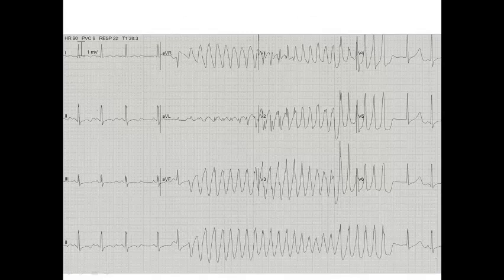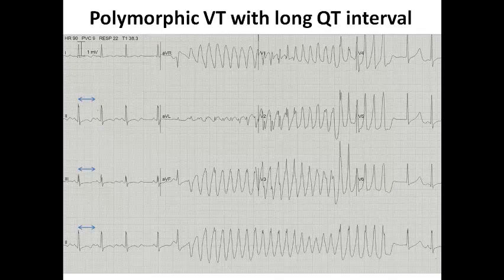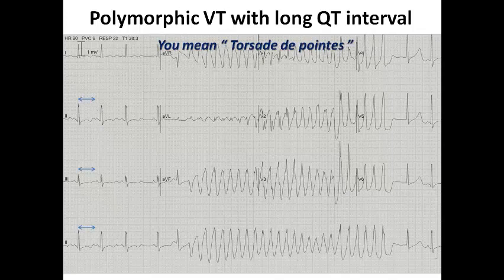In this ECG presentation — an important spot diagnosis — we can see a run of non-sustained ventricular tachycardia. It is polymorphic with multiple morphologies and continuous changing in axis and morphology. The axis is continuously changing at a very rapid rate with a 180-degree change. In the resting ECG preceding this non-sustained VT, we can see evidence of a prolonged QT interval, which is a predisposing factor for this VT.